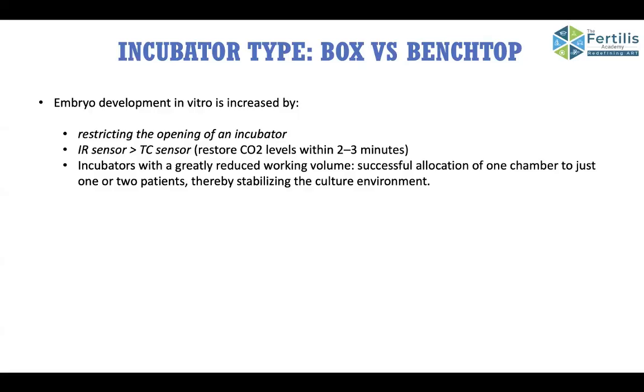Whereas in box incubators, only 6% CO2 is supplied by the cylinder through an inline filter, whereas 94% gas is being taken from the ambient air. The ambient air is very difficult to control, and you may not have tight control on the ambient air. So it is always better to have a benchtop incubator for prolonged culture.